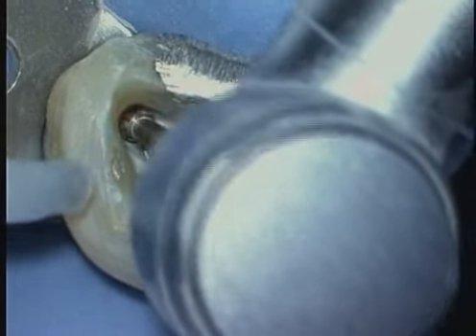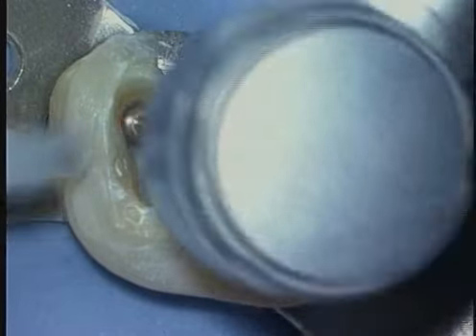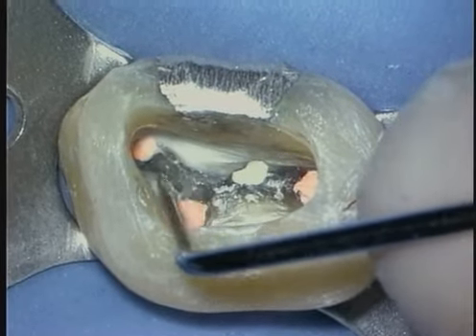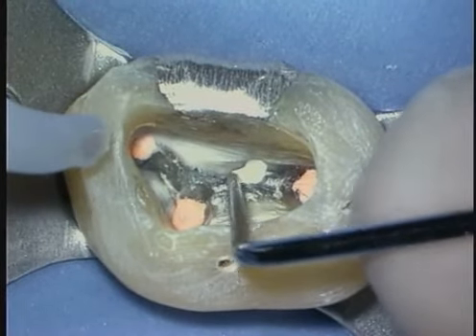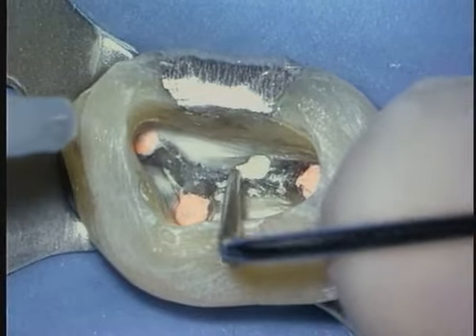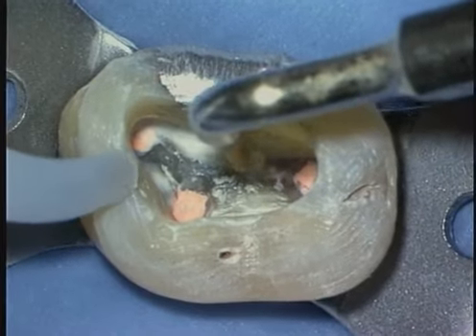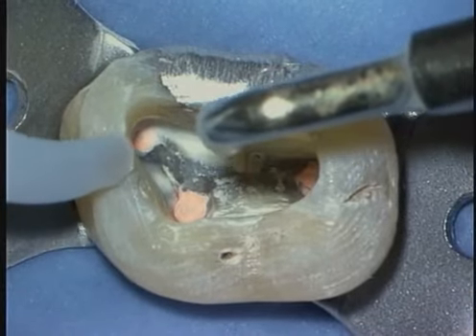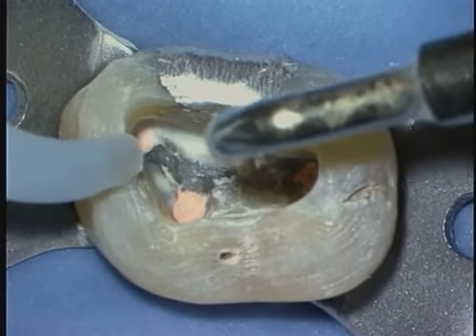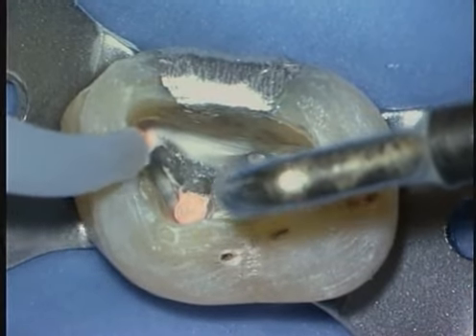Now, a lot of times we've been trained to look for the MB2 on an imaginary line between the MB1 and the palatal. And although frequently there is a groove there, and firm explorer pressure can be used to lean on it and see if you can pop through a roof of overlying dentin, we have to be aware that orifices can sometimes be displaced, and in this instance it looks like there's some material very close to the palatal system. In fact, this material may be there resultant to the pack on the original case. But we can begin to work on this area with ultrasonics and very carefully sculpt away the material.